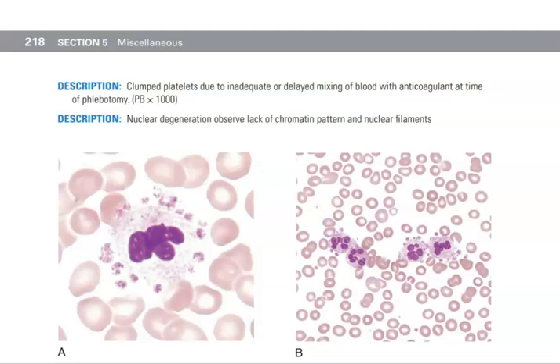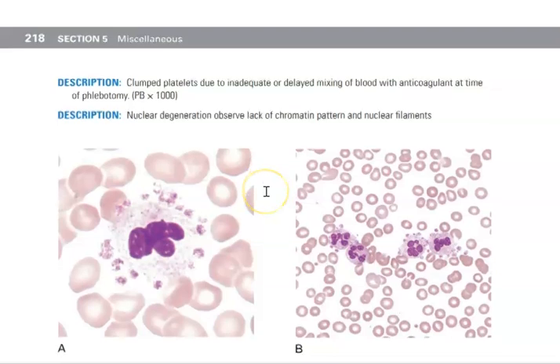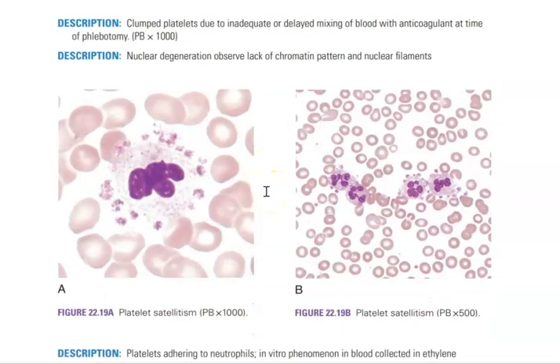The last artifact that we're going to look at is on page 218. This is called platelet satellitism. This is when your platelets clump around your neutrophils. See all these little platelets kind of surrounding your neutrophil. Remember, our neutrophil is one type of white blood cell, and all of our platelets have come and gathered around our neutrophil. So that's called platelet satellitism.